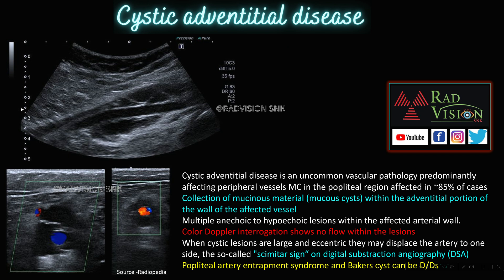On color Doppler, these cystic spaces do not show any color flow pattern, whereas the artery shows normal color flow. When these cystic lesions are large and eccentric, they may displace the artery to one side — this is called the scimitar sign on DSA. Other differentials include popliteal artery entrapment syndrome and Baker's cyst. Whenever you see multiple cystic spaces adjacent to the popliteal artery not taking up flow, definitely suspect cystic adventitial disease.